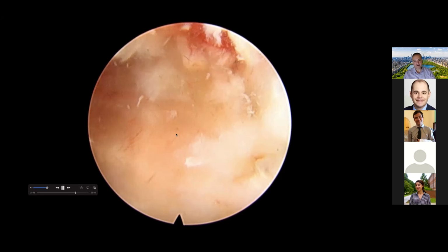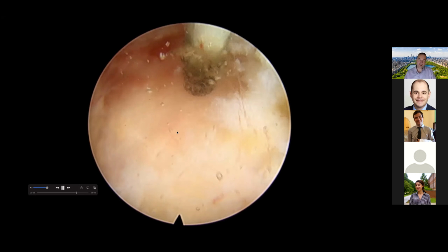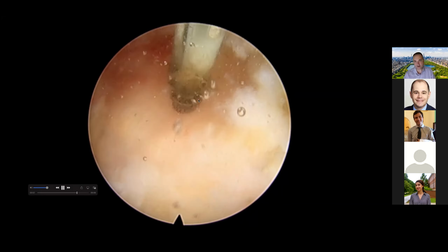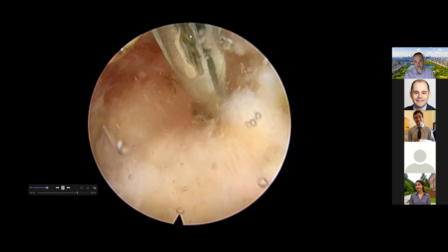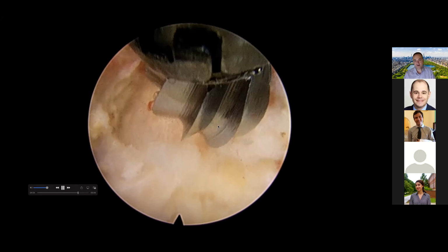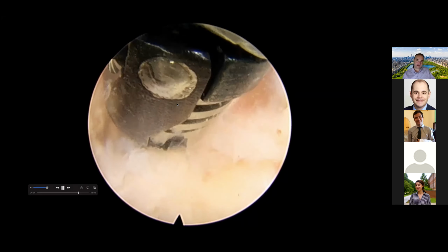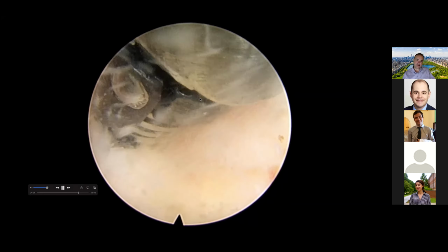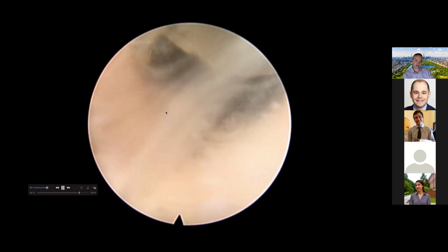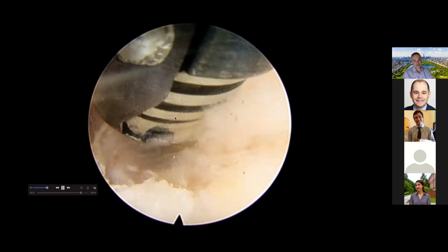on the screen of the endoscope, there's better contrast between the colors. And also, as I told you, surgery is 50% palpation here. I'm not relying only on the visualization, but I use that probe to palpate around and feel what is bone and what is flavum, what is ligament. And here is an articulating drill bit that allows us to reach over corners. You see how it articulates, and I have found that to be very, very useful for this type of case.